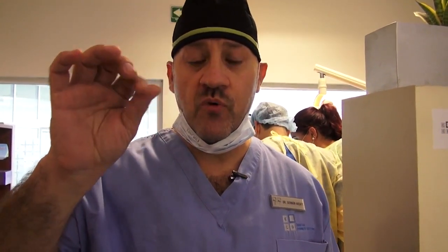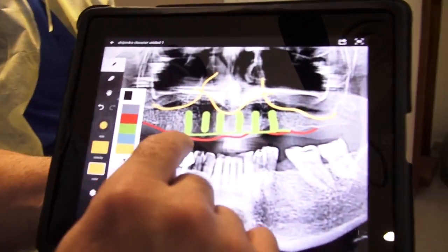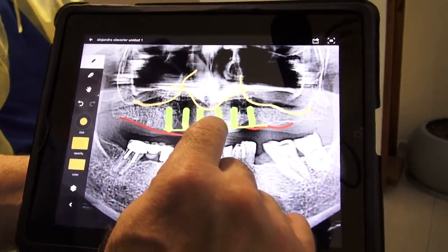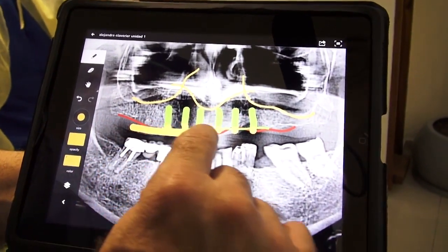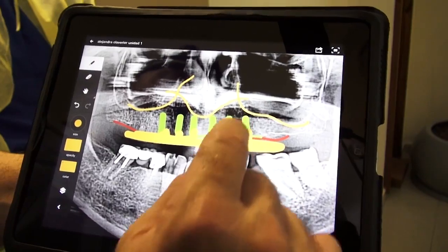Afterwards, we're going to remove those healing caps and take impressions. We're going to connect these implants with a screw-retained bar. This screw-retained bar will be attached to those implants and we're going to do a fixed hybrid upper restoration.